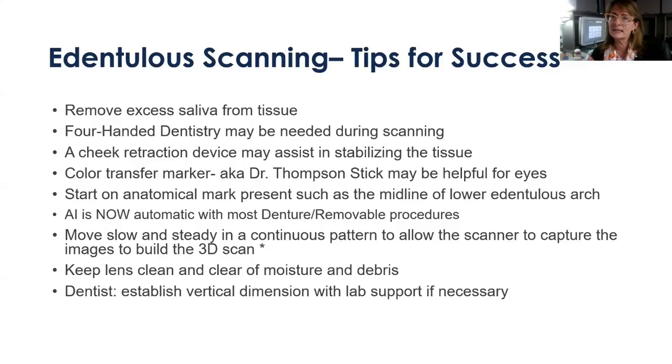And what's nice is, and we'll get to the RX in a few minutes, there are so many great choices, and your ability to turn AI on or AI off. You do want to make sure that you are moving in a very steady, methodical, continuous pattern to allow the data to stitch together to the best of your abilities.